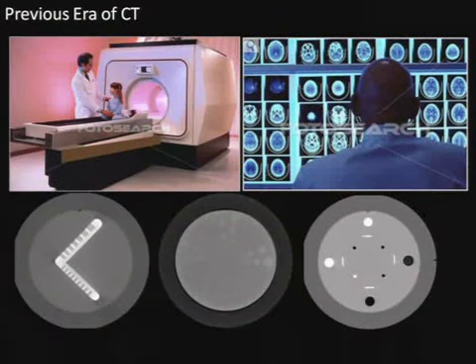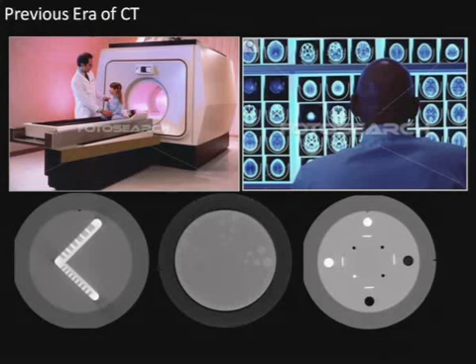All right, so this is where it all began, and some of you in the room were around in this era when CT scanners had the same shape as the cars of the 70s, and the only output really was a sheet of film, and that was true for the radiologist, and it was true for the physicist as well. Before PACS, before DICOM, back in the 70s and 80s, the only way you were going to ever look at anything pertaining to image quality was printed out on these pieces of film. As a result, we have phantoms that have inserts that allow subjective eyeball-based assessment of both spatial resolution and contrast resolution, slice thickness, and other modules that you're all familiar with.